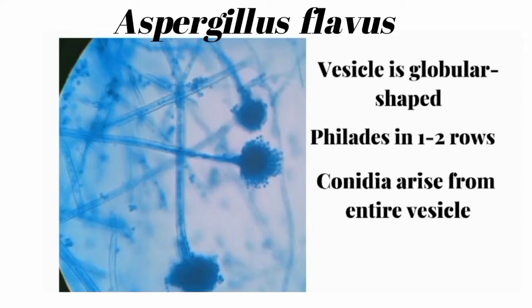Next one is Aspergillus flavus. The vesicle is globular shaped, similar to Aspergillus niger. Phialides are present in one or two rows. Conidia arise from the entire vesicle.